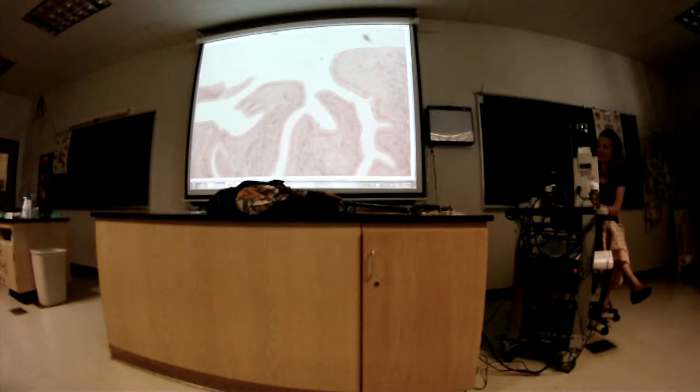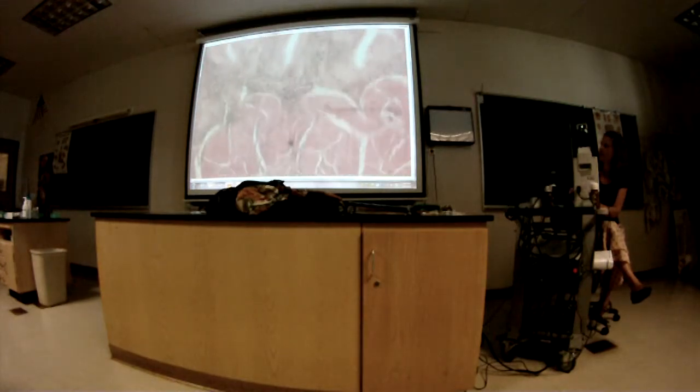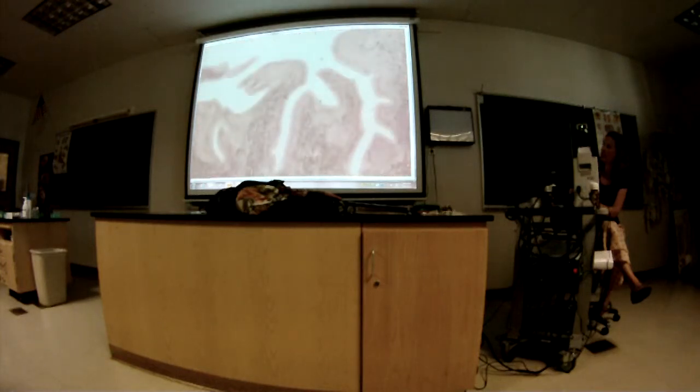This one, I didn't really get a good view for you. I didn't last time either. It's the ureter. What organ are we looking at, out of focus? So this is the lumen up here. It looks like it's empty. The bladder. And this is what the deeper layers look like. Urinary bladder? Yes.